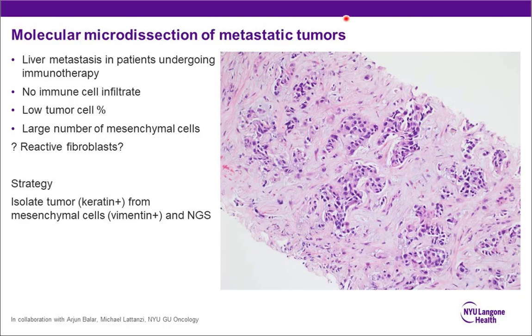So that kind of bummed. Yes, the hypothesis was wrong. There was no immune population. But what we noticed is that in addition to these carcinoma cells that were pretty obvious, there was a very exuberant, what we thought is a fibroblastic proliferation in the background. You can see this myxoid stroma in the background, these spindle cells in some areas, probably more obvious than the others. They also are quite pleomorphic.